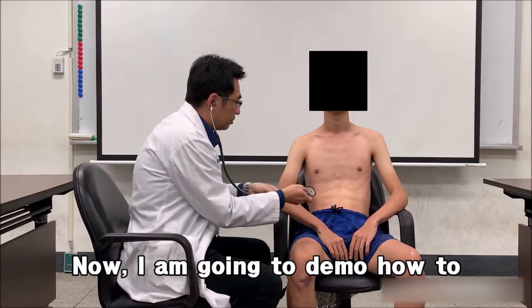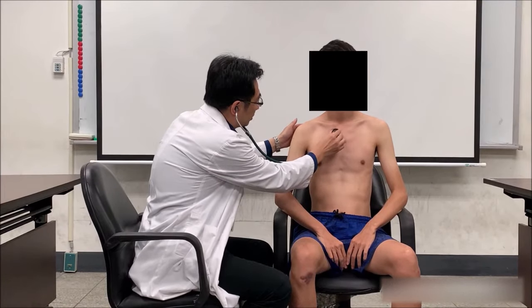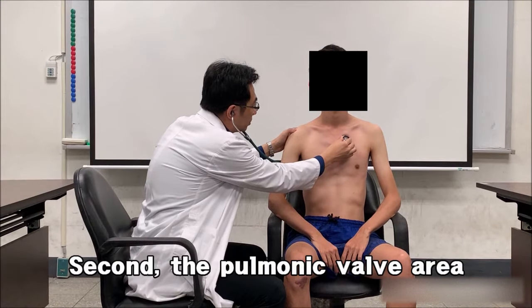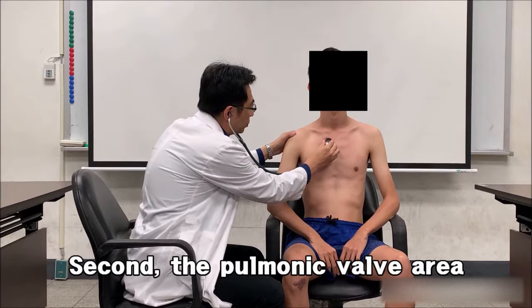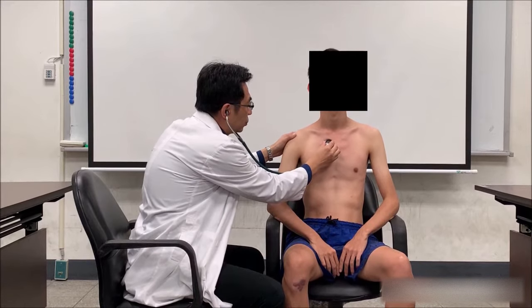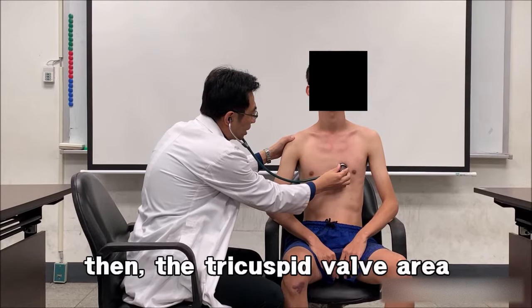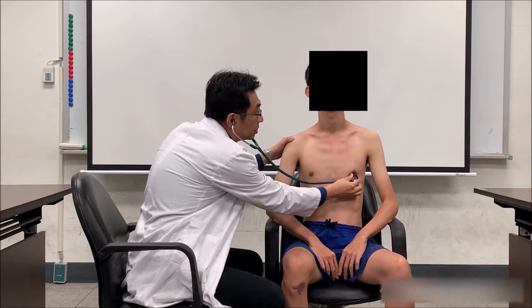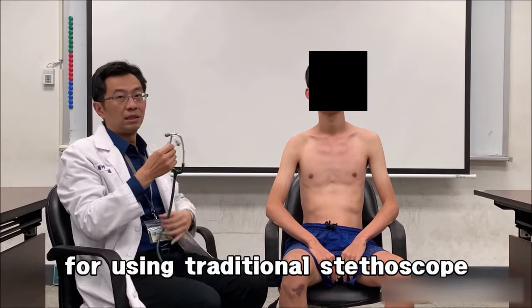Now, I am going to demo how to use a traditional stethoscope for auscultation. First, listen to the aortic valve area. Second, the pulmonic valve area. Then, the tricuspid valve area. Last, the mitral area. The above is a simple flow for using a traditional stethoscope for auscultation.